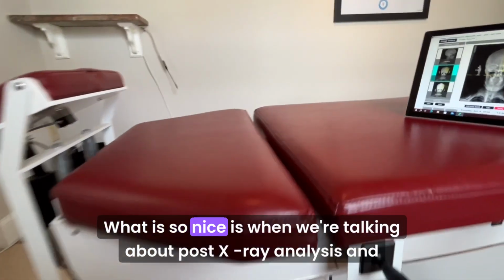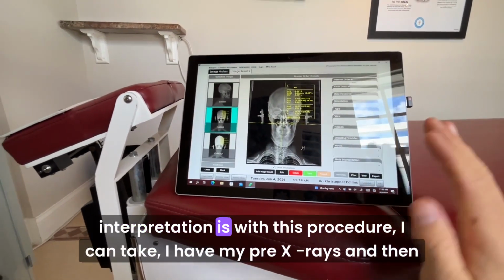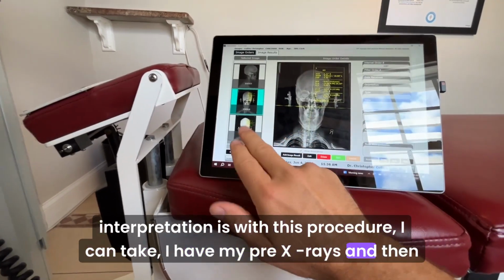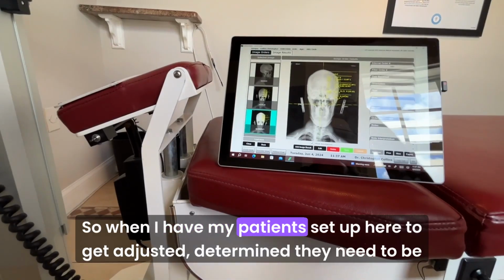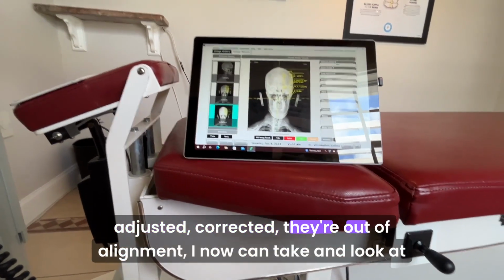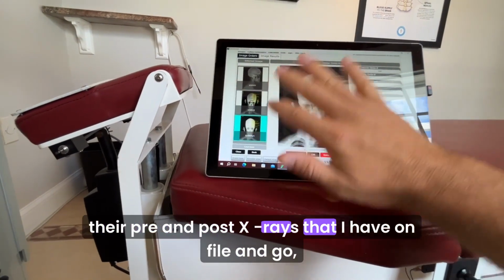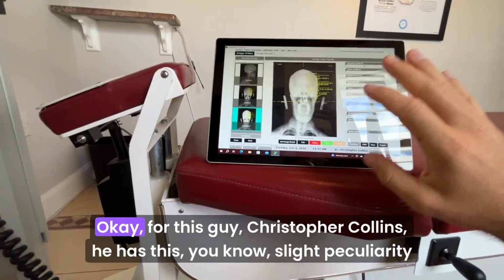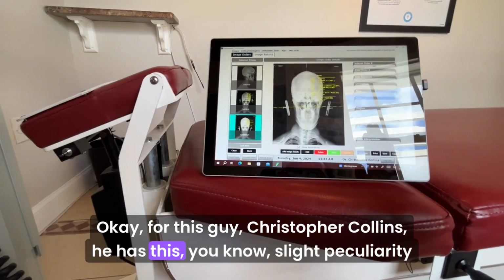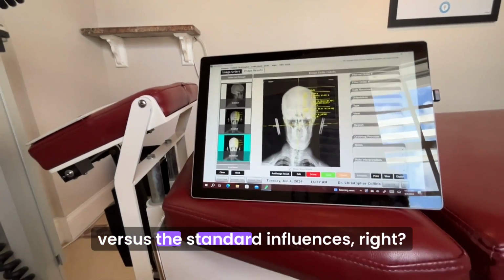What is so nice is when we're talking about post X-ray analysis and interpretation is with this procedure, I have my pre-X-rays and then I'll have my post X-rays. So when I have my patient set up here to get adjusted, determine they need to be corrected, they're out of alignment, I now can take and look at their pre and post X-rays that I have on file and go, okay, for this guy, Christopher Collins, he has this slight peculiarity versus the standard influences, right?